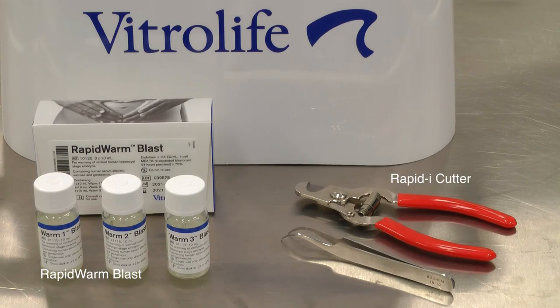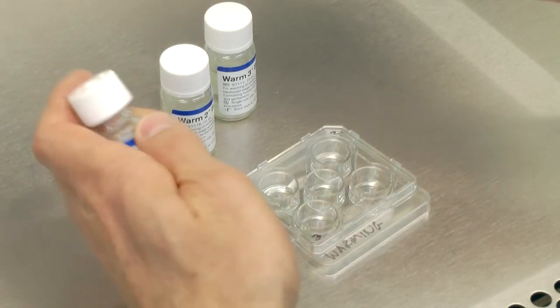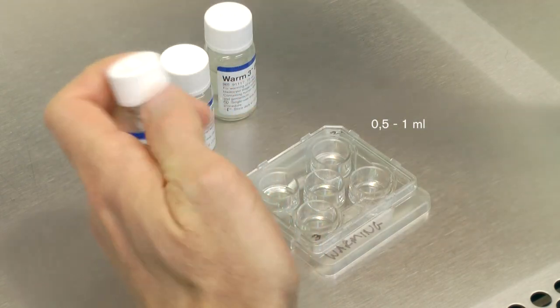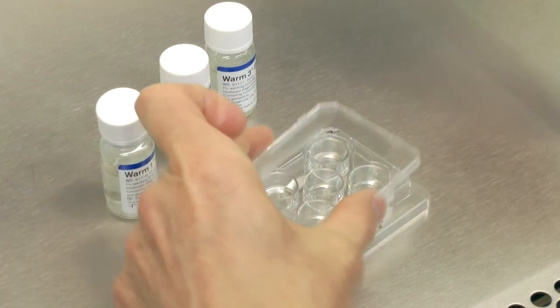the five-well culture dish, and the smart box containing liquid nitrogen. Place between 0.5 and 1 ml of each of the warming solutions in a separate well of a five-well culture dish. Place the lid back on and heat to 37 degrees Celsius.